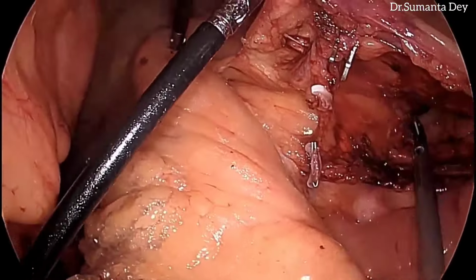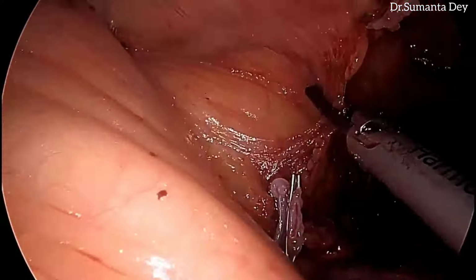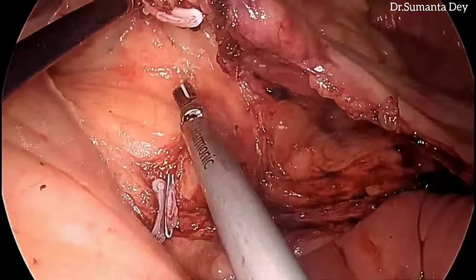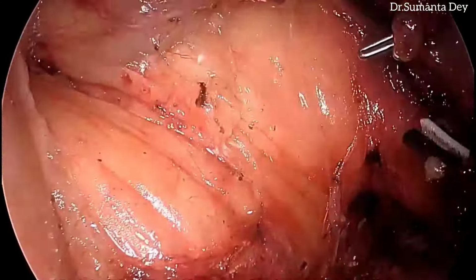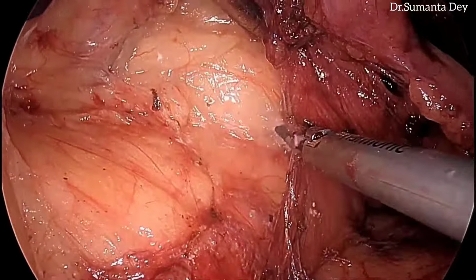Now we can lift up the mesocolon from the anterior surface of the pancreas. This is the pancreas. Just where I am dividing now, just below it, is the anterior surface of the pancreas, and I am gradually lifting, clearing, creating a plane between the mesocolon and the anterior surface of the pancreas, and gradually we'll proceed further with the medial to lateral dissection.